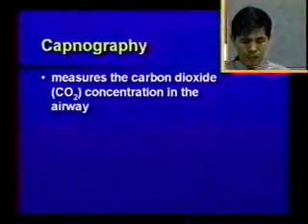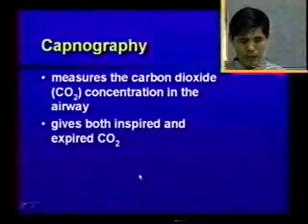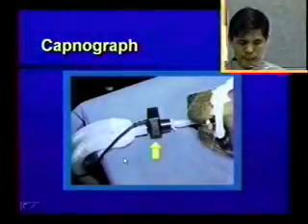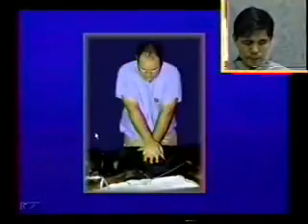How about capnography? Capnography measures the carbon dioxide concentration in the airway. It measures both the expired as well as the inspired CO2 concentration. So here's just a picture of a mainstream capnograph. It is actually attached between the endotracheal tube and the breathing circuit.